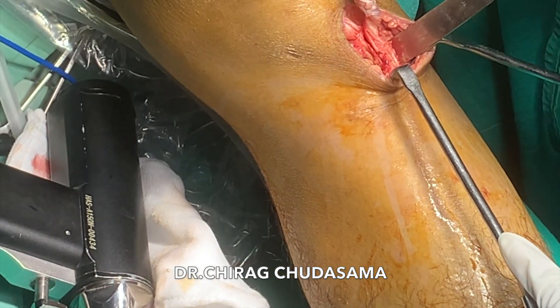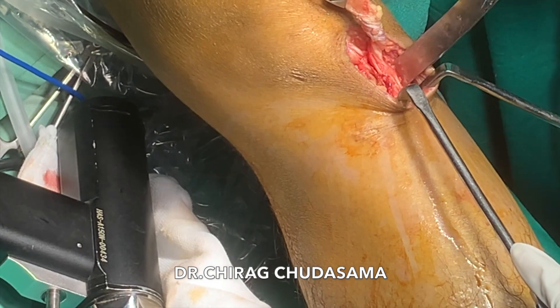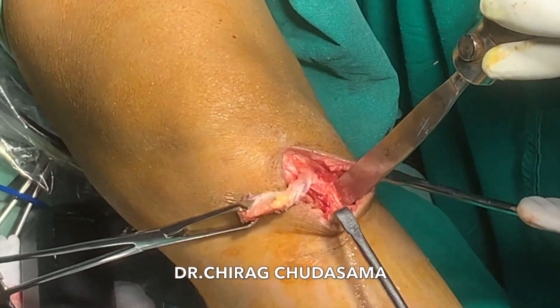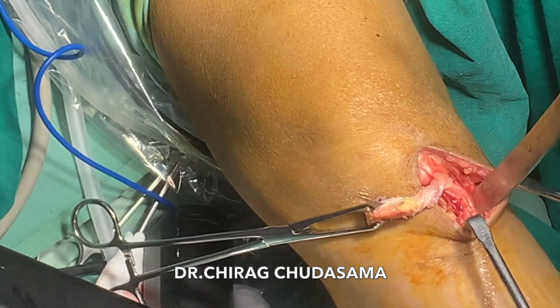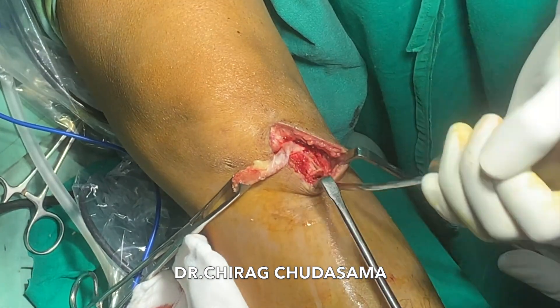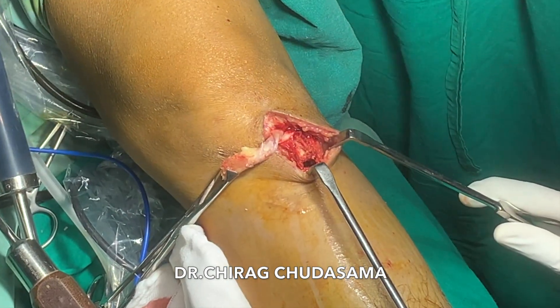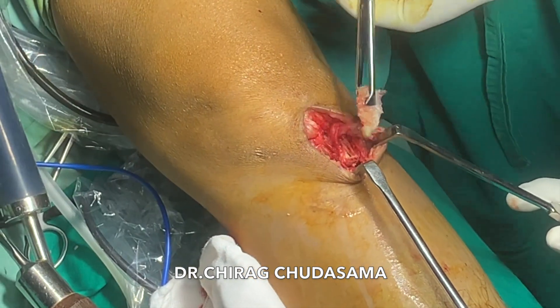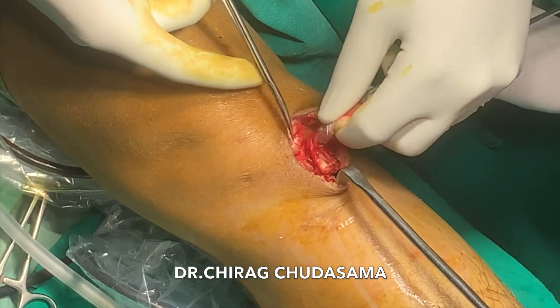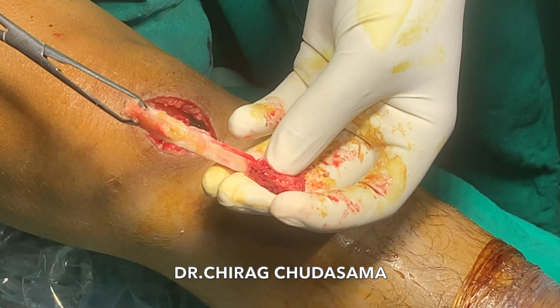Once you are sure that the osteotomy is good enough on both sides, you can use an 8 mm curved osteotome on the distal side of the tibial tuberosity. This is how you can harvest the tibial tuberosity plug. Once you harvest the tibial tuberosity plug, you hold it with Alice forceps and separate it from the surrounding soft tissue using scissors. This is how the graft harvest is complete.